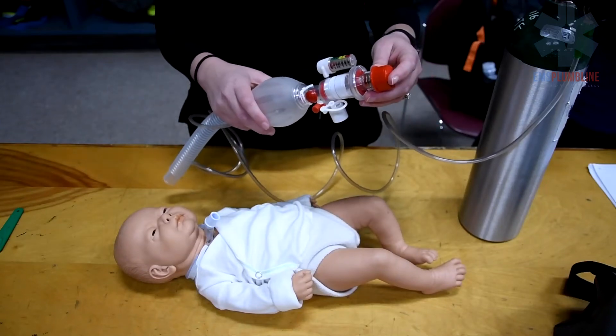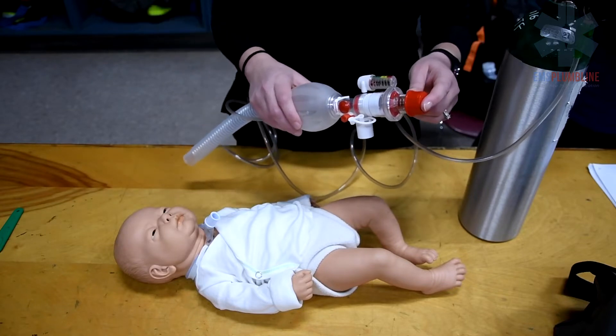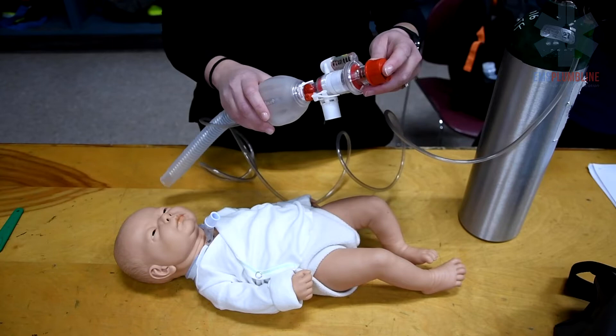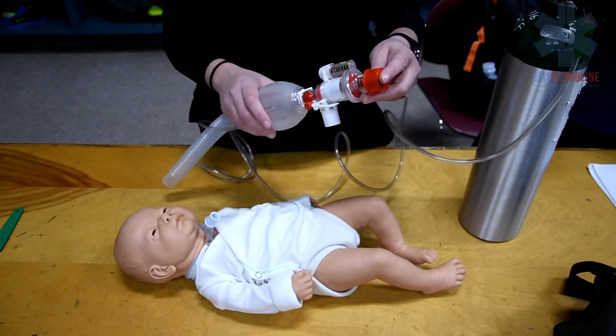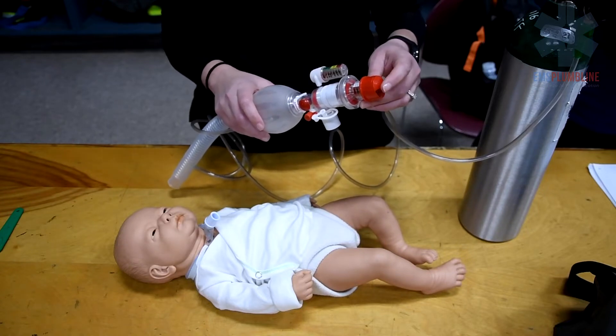An Ambu bag, or resuscitation bag, is the primary piece of emergency equipment for children with a tracheostomy tube. Three sizes are generally utilized: infant, pediatric, and adult. Always try to use the child's own Ambu bag, as this is specific to their size and lungs.